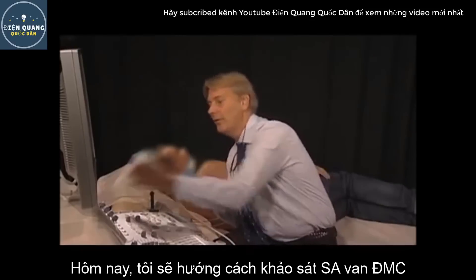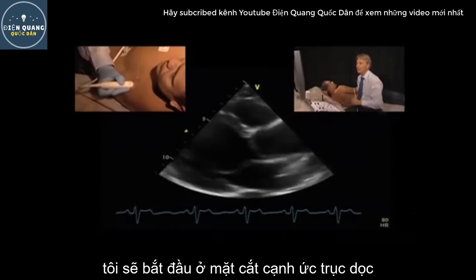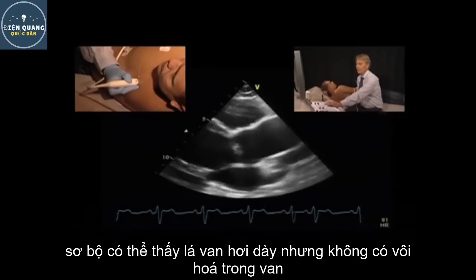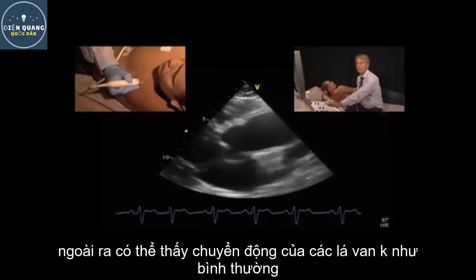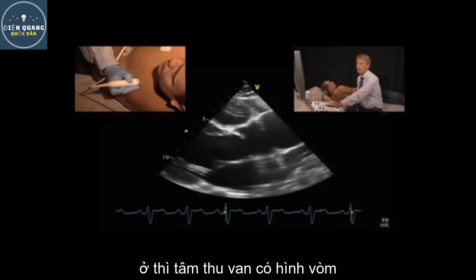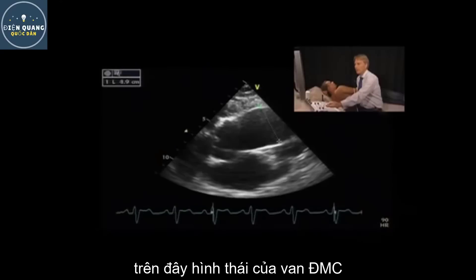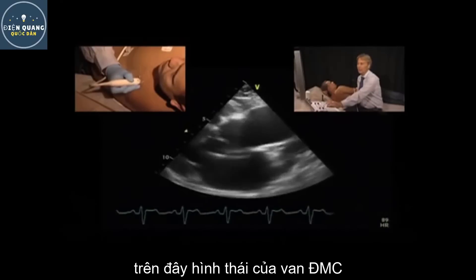Let's take a look at this patient with respect to his aortic valve. We'll start with the parasternal long axis view. We can appreciate that the patient has a mildly thickened aortic valve, but there are no calcifications. We also see that the motion of the aortic valve is abnormal — there is doming of the aortic valve in systole. In addition, the ascending aorta is also dilated. Together with the morphology of the valve, this is almost indicative of a bicuspid aortic valve.